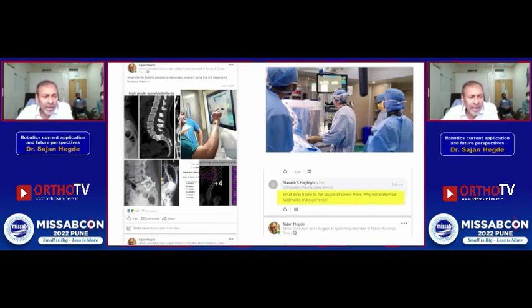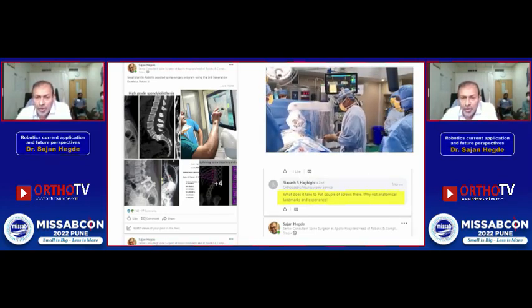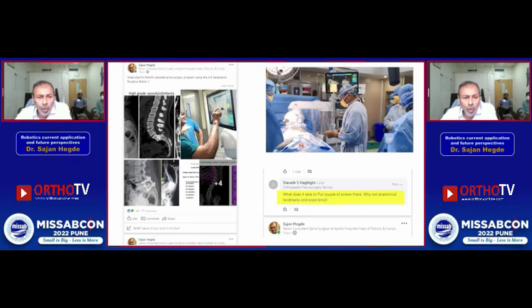So this is what we were doing for a high-grade spondy. And I put it on LinkedIn, and then somebody got back, hey, what does it take to put a couple of screws? So I go back to my point. You do need it sometimes, and it is great to have this new tool.